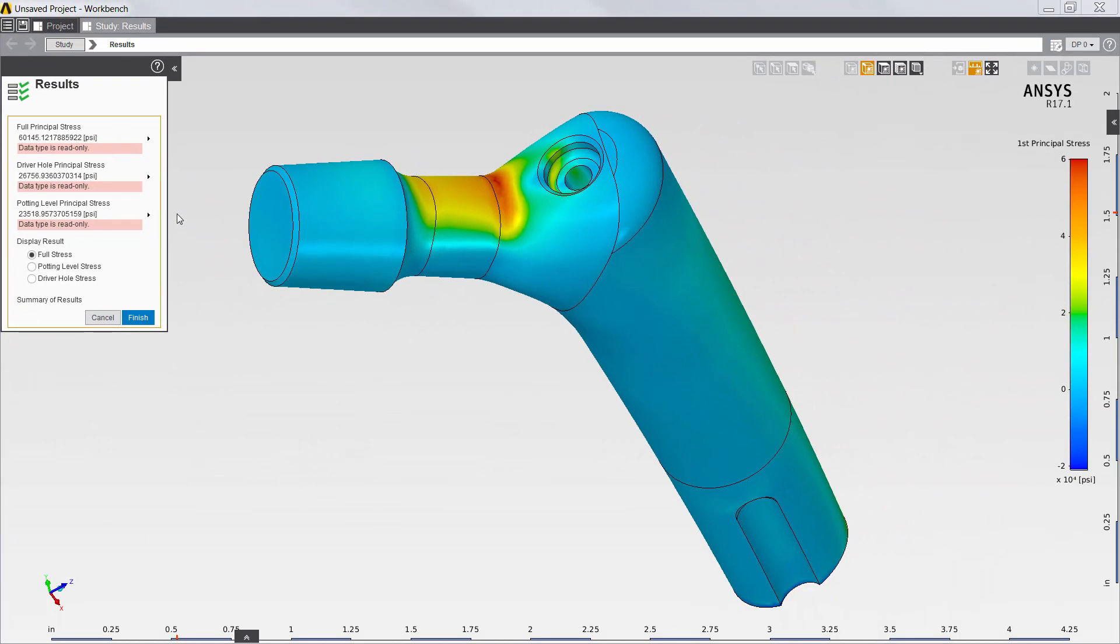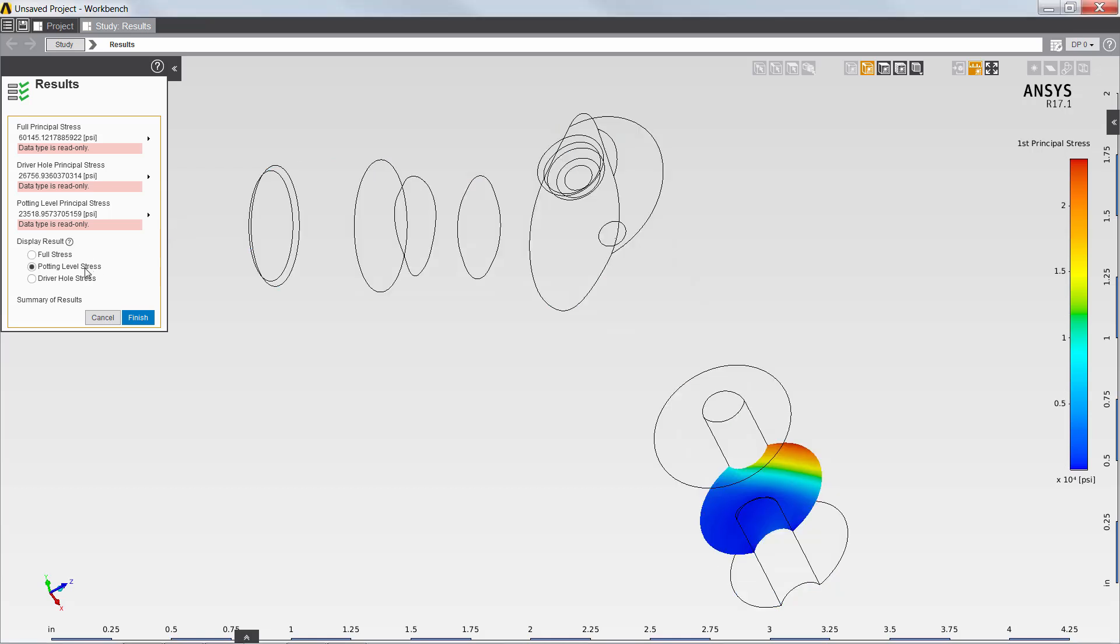The app also allows me to easily toggle between the display of the first principal stress in the full model, at the potting level, and also at the driver hole.